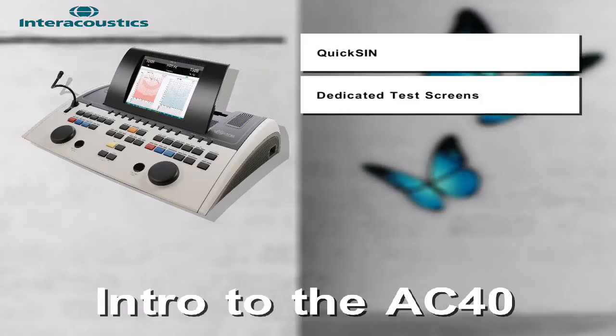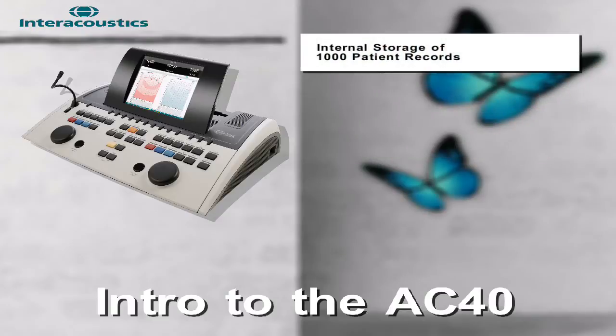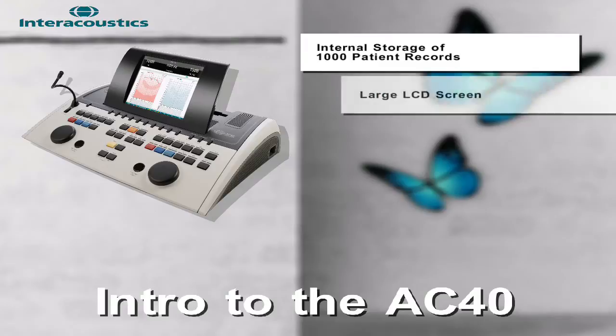Other features of this device include an incorporated new test stimulus called pediatric noise. This stimulus provides an alternative to warble tone and narrow band noise, in particular for pediatric testing. The AC40 has an internal storage of a thousand patient records and a large LCD screen to make testing easier.